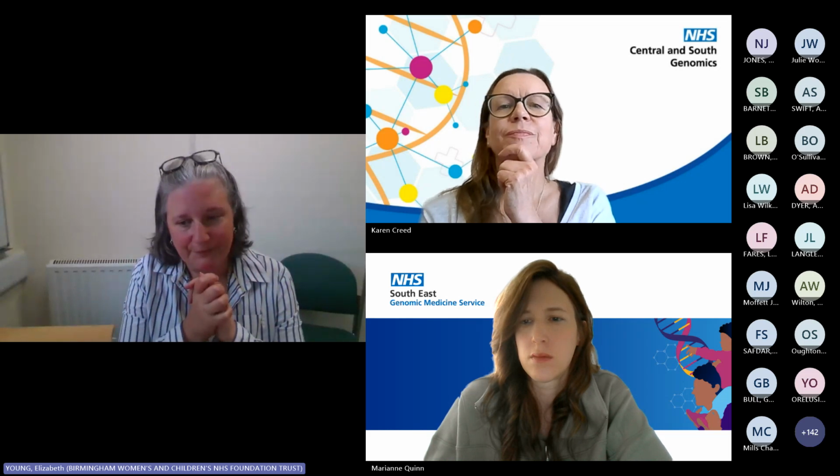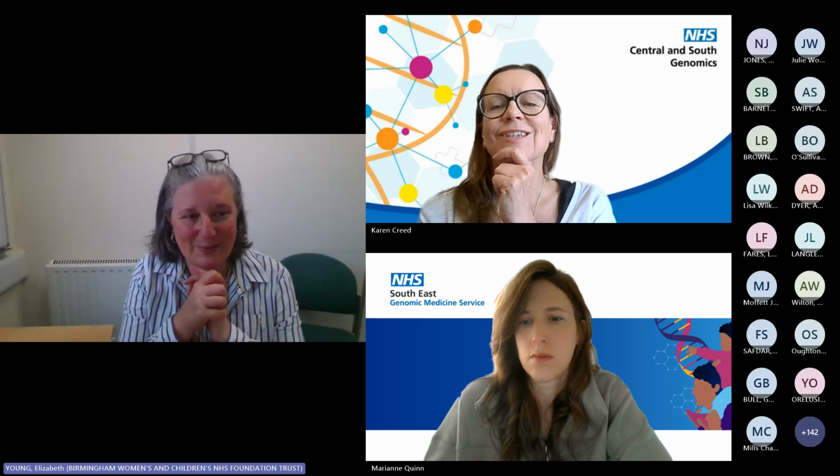Nadia's nodding. I do understand that every lab in the UK offering the QF PCR will do this digest, so you get a fully representative picture of the placenta. It's much reduced the number of false CPM results.